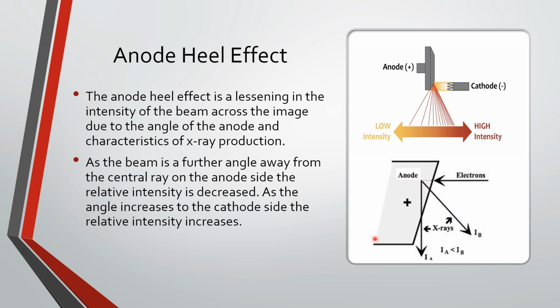It's taking the hypotenuse, okay? So it would have to go farther and farther. The greater the field of view, the more opened up it is to go through the anode. But if there's a little angle on it, this effect is minimized. I hope we can visualize that here with this, all right?